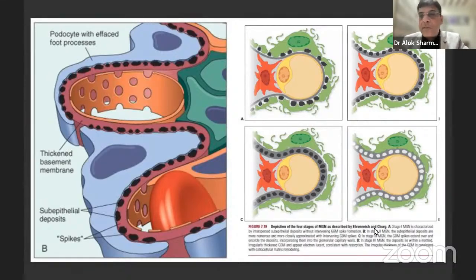And apart from this, it really does not have a very significant clinical correlate or outcome. So you can't really make much out of a clinical nature of the disease, apart from saying that the glomerular deposits themselves have become old. The reason I'm telling you here is because even when you have stage 3 or even stage 4 appearing glomeruli, you can have a minimal tubulointerstitial chronicity. So this staging actually pertains only to the glomerular progression of the disease and not to the progression of the disease overall, as you may like.